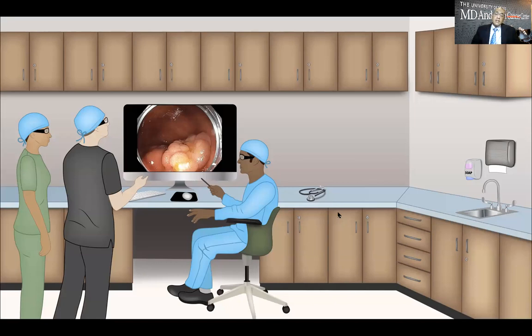It will be very cost effective, and that's what I do in my practice. And as part of the practice, it's always a good idea to share with your team what type of polyp you are going to cut if that polyp has been referred to you. And also have a game plan of sharing with your team what type of equipment you need so that you have everything ready in your room.